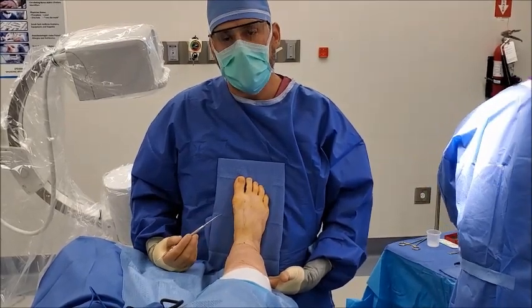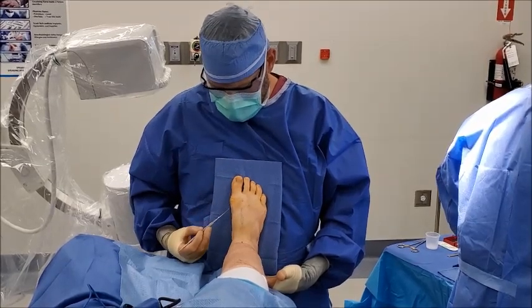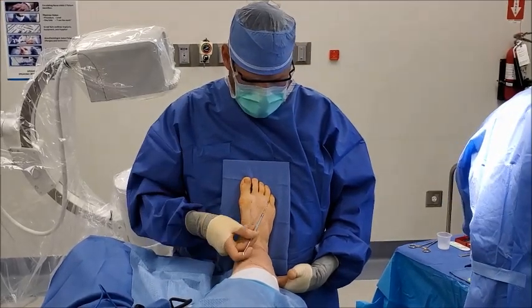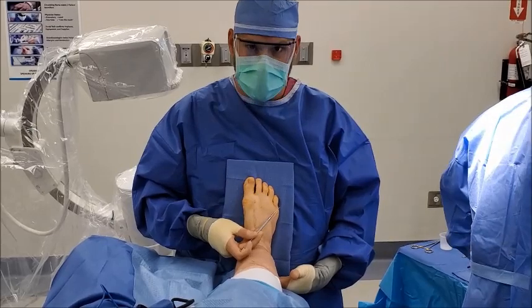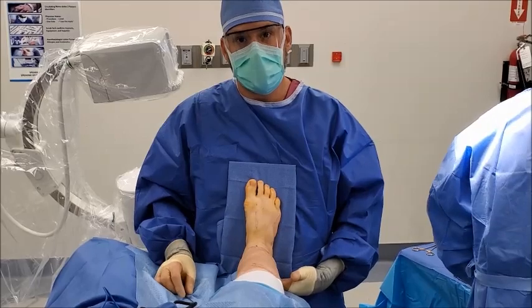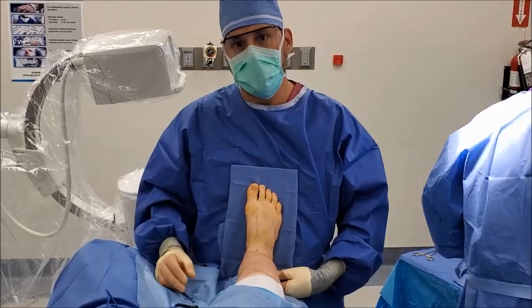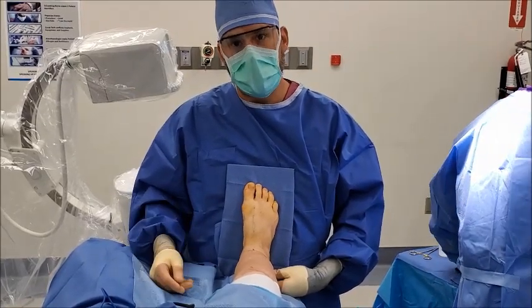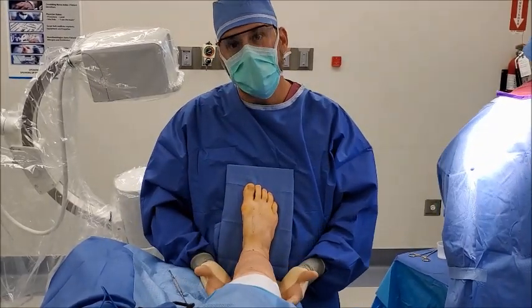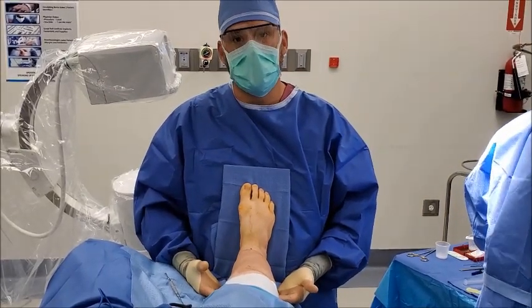We've completed the minimal incision lapoplasty procedure. You can see the incision is closed cosmetically, so the patient will have a very thin scar. We also performed a few additional procedures given the severity of her bunion deformity, as well as repair of a tailor's bunion on the other side of the foot. The patient will be in a dressing for about three days, with sutures removed at two weeks. She'll be allowed to bear weight throughout, walking in a boot without assistance by weeks three to four, back in an athletic shoe at week six, and back to full normal activity by three months.